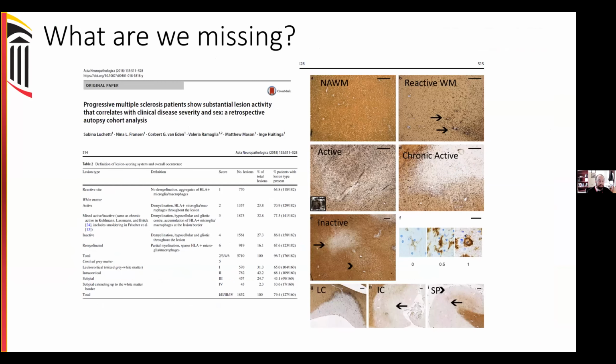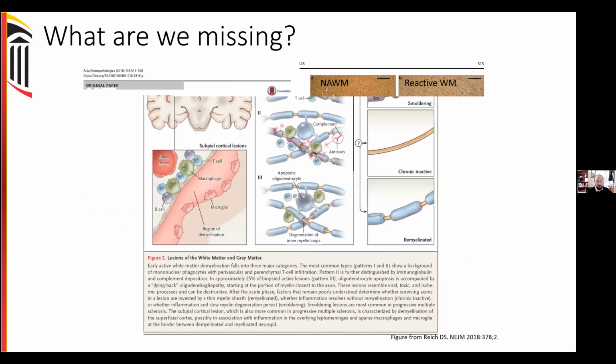Even when we talk about white matter lesions, the white matter lesions themselves are not all the same. So white matter lesions can have an active component, and that's usually when it's a brand new lesion and it's going to have active breakdown of the blood-brain barrier. But those active lesions can transition over time into being either inactive, so not having any continued active inflammation going on, or can become chronic active, where there's slow, continuous inflammation within the lesion or at the edge of the lesion that perhaps slowly expands it over time.